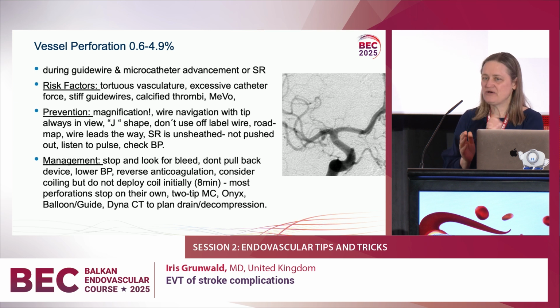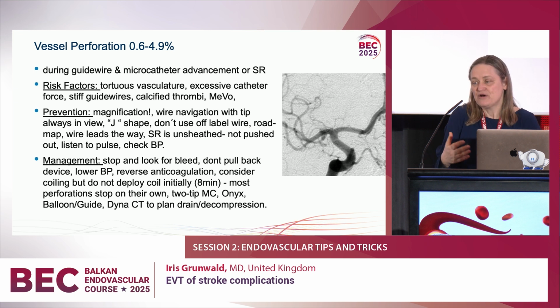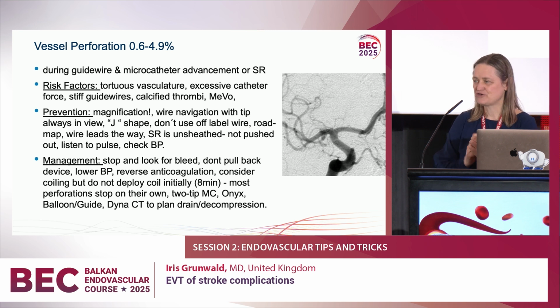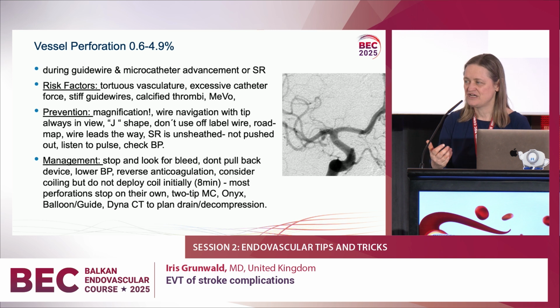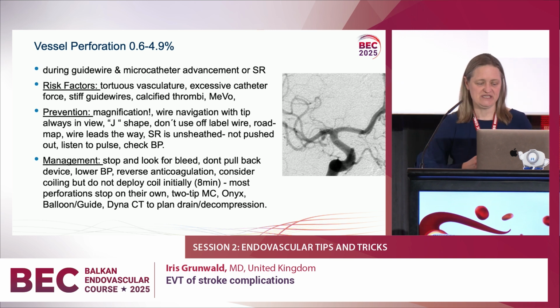Next thing is lower the blood pressure. Very interestingly, very often you hear in thrombectomy procedures as well, probably taken from aneurysm coiling, where we use a lot of heparin or anticoagulants, to reverse the heparin, protamine use. In thrombectomy procedures, we hardly have any heparin. We do these procedures with probably only heparin in the flushes. We avoid giving heparin in thrombectomy procedures.